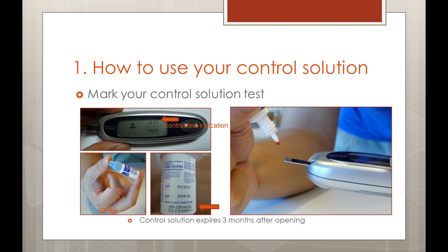Shake your control solution bottle, remove the cap, and squeeze out and discard the first drop. Wipe the tip with a clean tissue. Holding the bottle upside down, carefully squeeze out a hanging drop. Hold the drop to the top edge of your test strip as before until the narrow channel is full and your meter beeps or counts down. Your results should match the range on your test strip vial. If you get repeated abnormal results, stop using the meter and test strips and contact the glucometer manufacturer for further assistance.